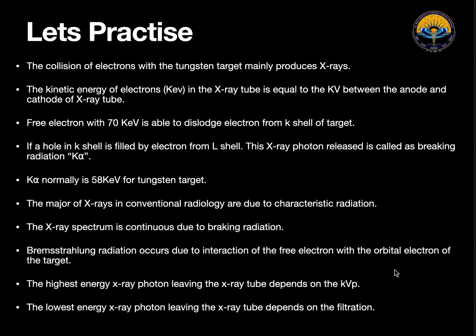The highest energy X-ray photon leaving the X-ray tube depends on the kVp. That is a true statement. The lowest energy X-ray photon leaving the X-ray tube depends on the filtration. That is also a true statement.